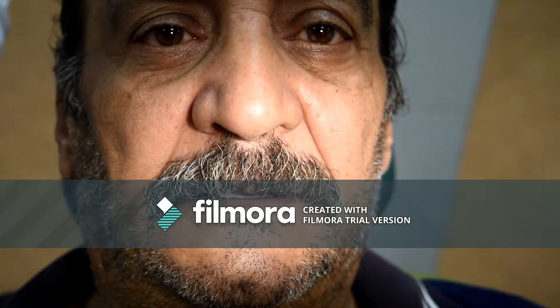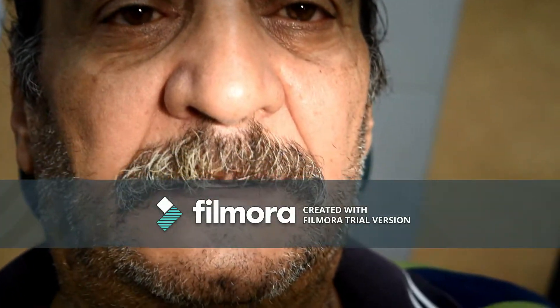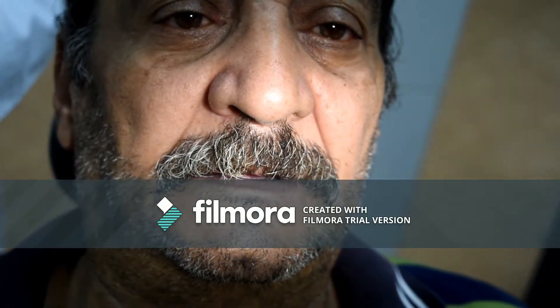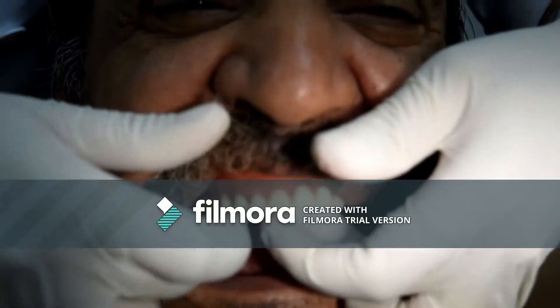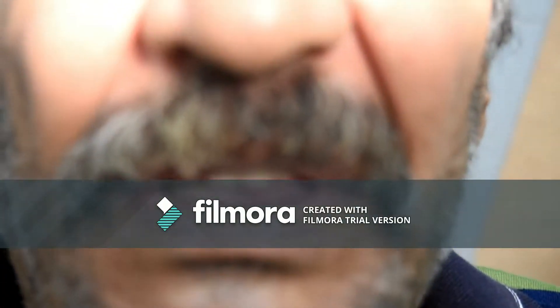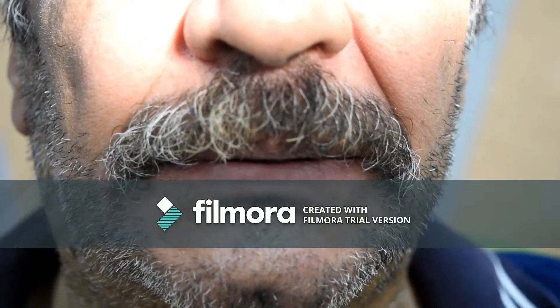Then you have to check the case inside the patient's mouth. You have to check the upper trial denture base alone and the lower alone, then check both with each other. Regarding the upper trial denture base, you have to check the extension, retention, and stability first.